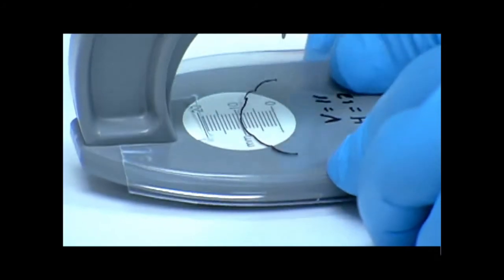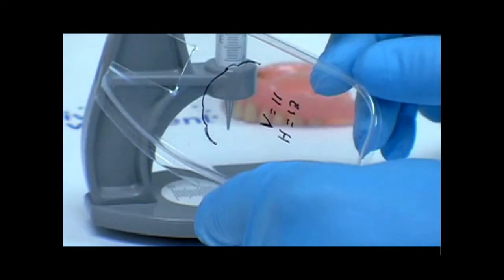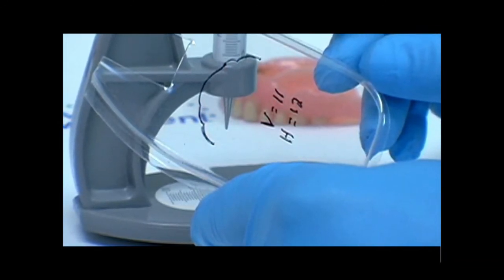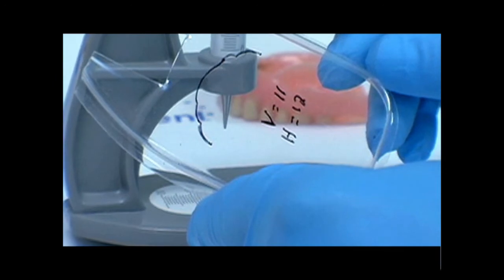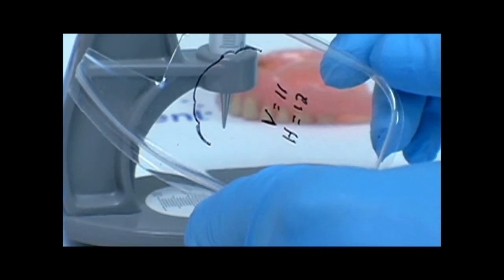So this will snap off our Alma gauge, and you could put the patient's name on this and put this right into their case pan. That'll be sent to the laboratory and becomes a part of their prescription, a very nice, essential part of the communication between you and the laboratory, taking advantage of the fact that the patient had existing dentures and we're able to make some personalized determinations to facilitate our communication to the laboratory.